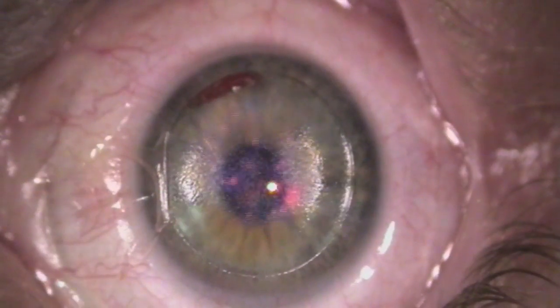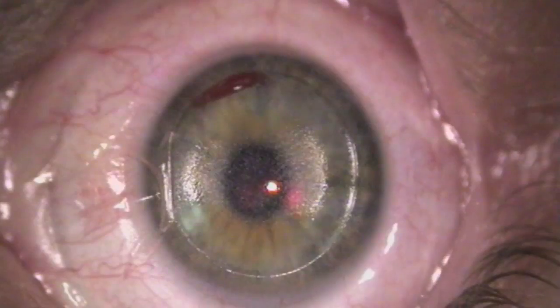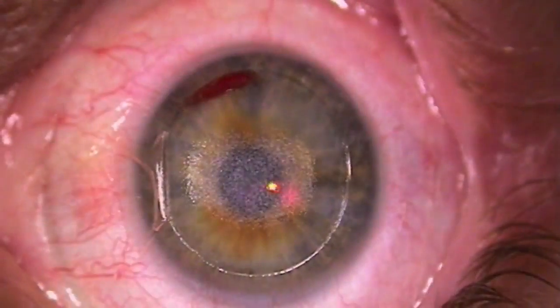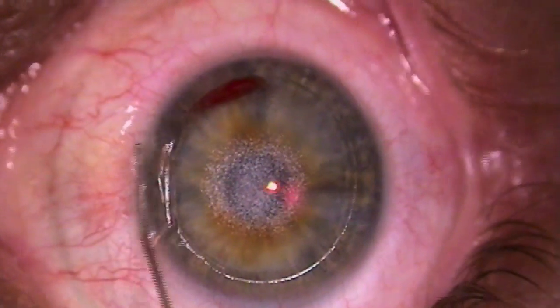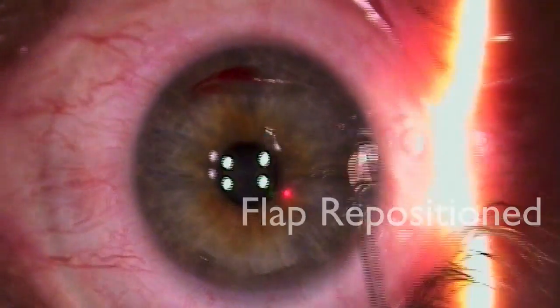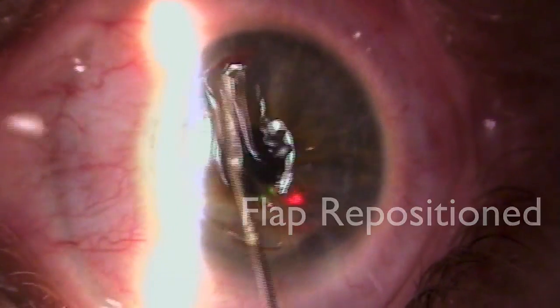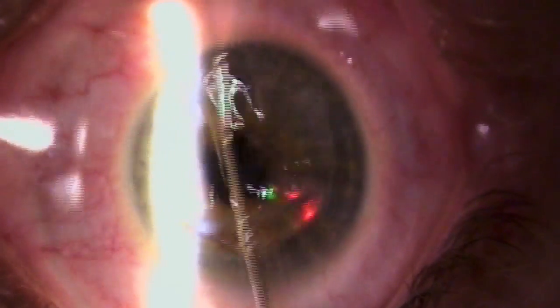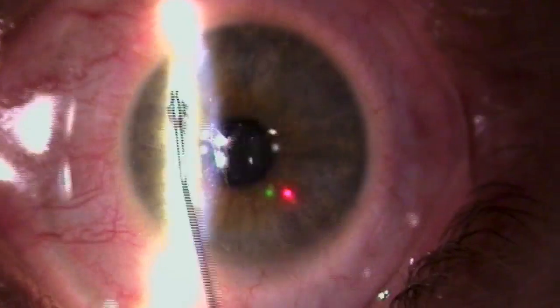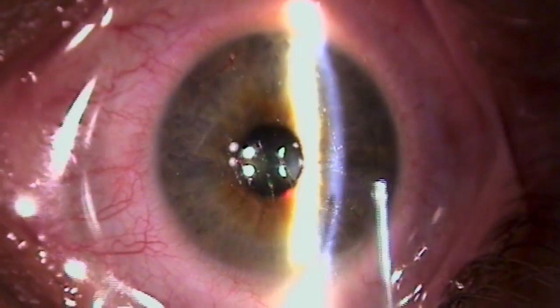Perfect, couldn't be better. Let's go ahead and show you the green light again. There are a bunch of drops here — there's the green light. Sorry about the drops. Not too bad — good job.